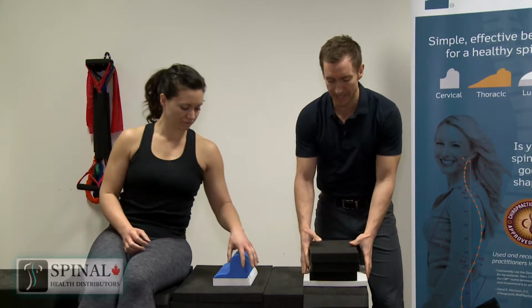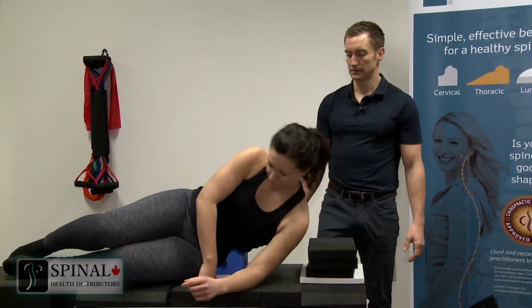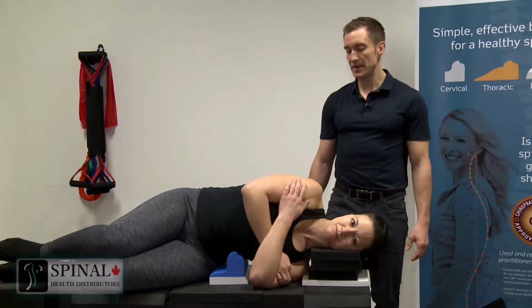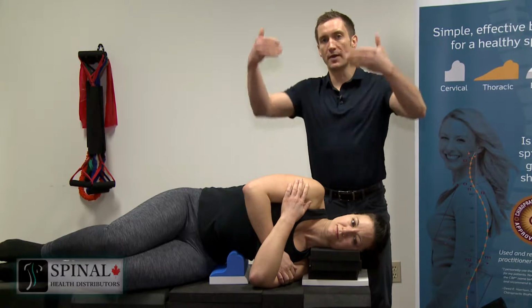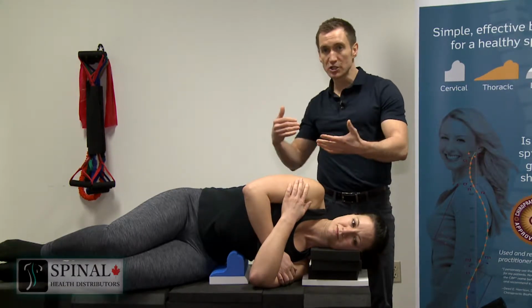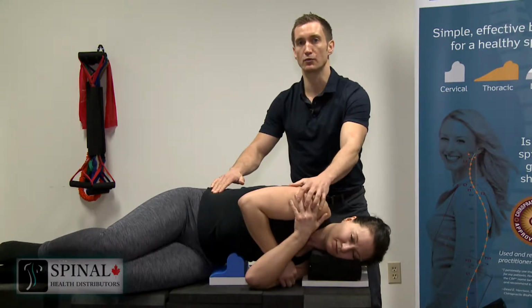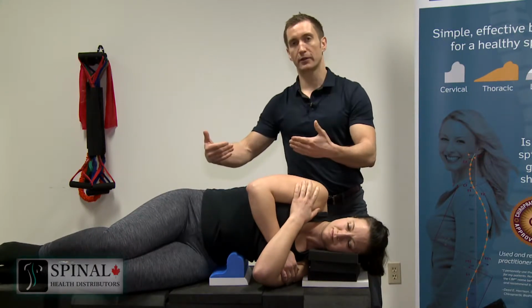So we're going to have our patient lay on our left side, and we're setting up a head support here for the patient. The patient would do this on the floor at home. Things to pay attention for are, when the patient lays on the Scoliroll, we want them to be perpendicular to the floor. We want to avoid any rotation in the spine. Sometimes you'll see either slouching of the shoulder forward or rotating backwards. So we want to avoid that. We teach them perpendicular to the floor.